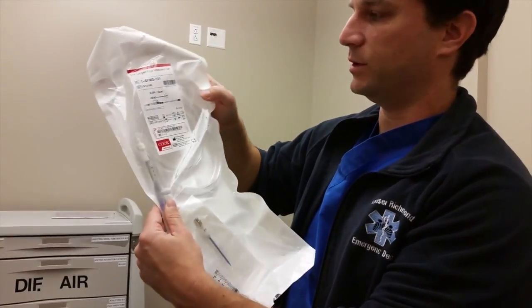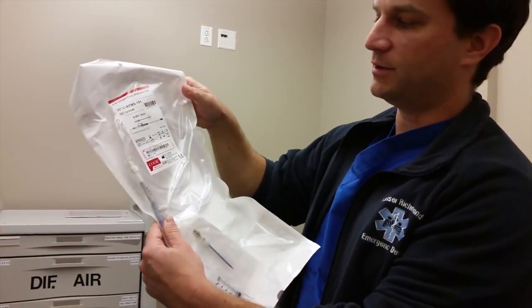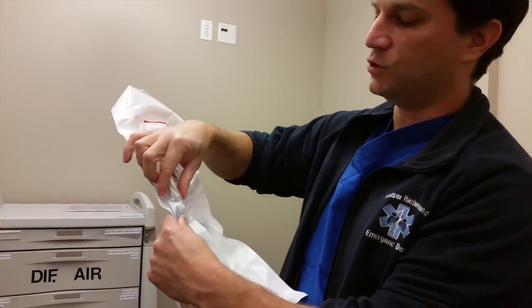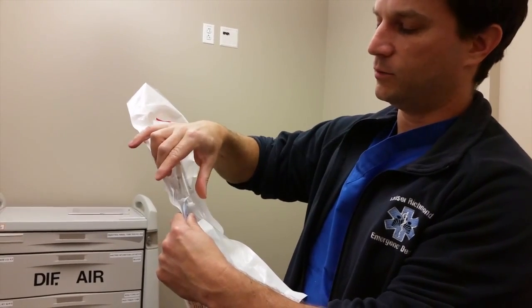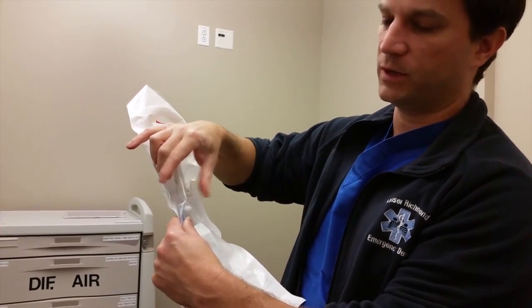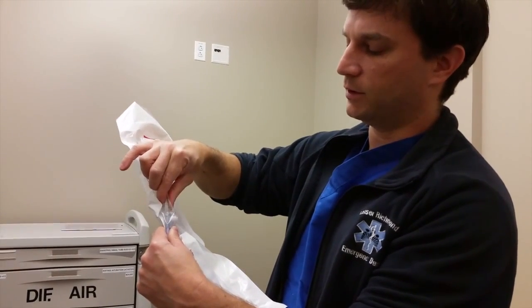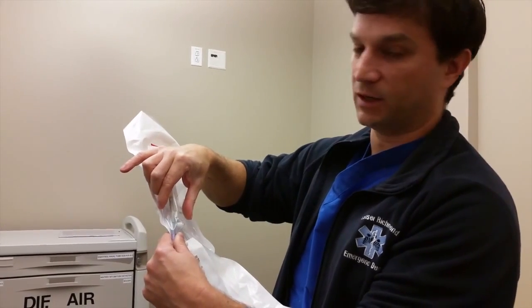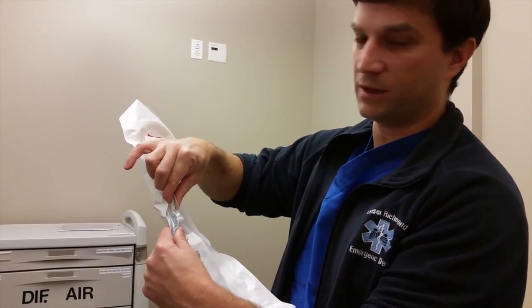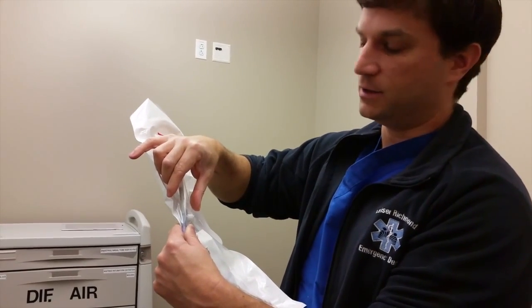But in this case, since we don't really have that luxury, you just hook it up to the Christmas tree adapter and turn up the oxygen as high as you can. And you will breathe for them in a 3 to 1 rhythm. The blast is 1 second long, and you take 3 seconds to let them ventilate off. You don't need that much time with oxygen going in, but you need time to let the CO2 come out.